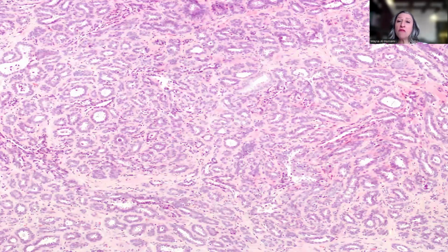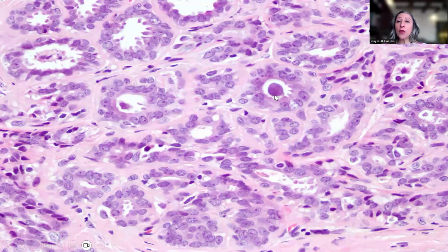Now, in another focus of the tumor, there was this very florid growth. And again, to the junior pathologist or to an unwary pathologist, this might be confused with invasive carcinoma. But actually, if you zoom in at high power, we have calcification, but we have epithelial and myoepithelial cell layers. So this is the dual lining that we typically see with benign breast proliferation.